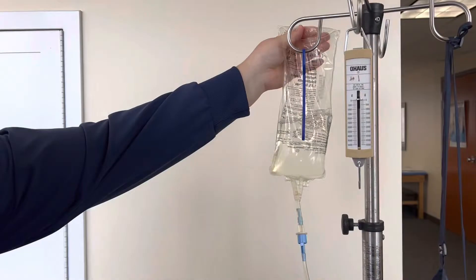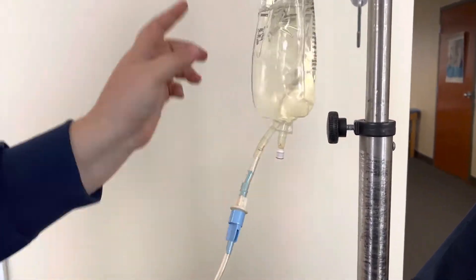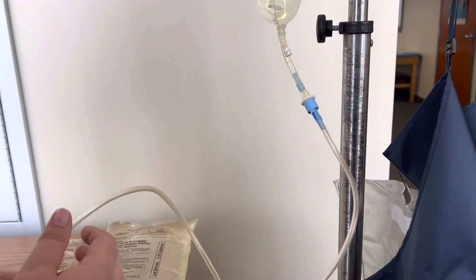This hangs on the pole here and you're not going to open this flange yet. Just keep it hanging there — you don't have to do anything else with it.